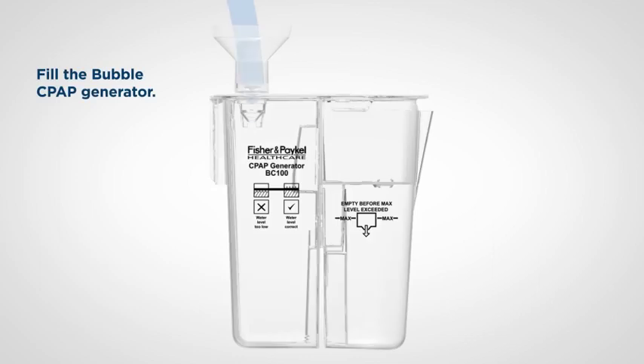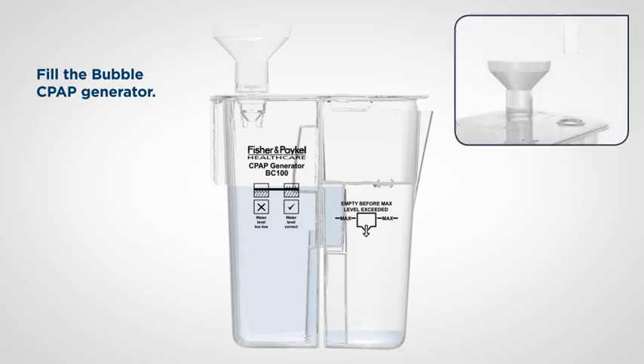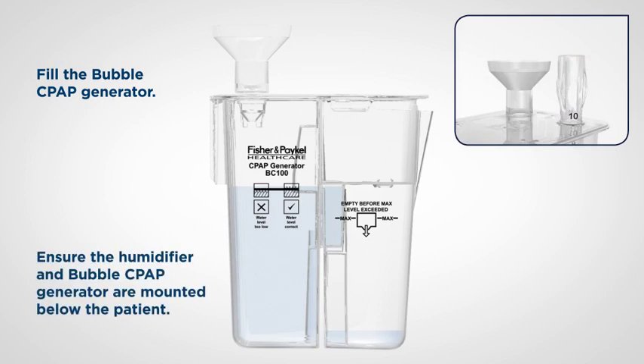Using the fill funnel provided, fill the CPAP generator with sterile water until the water reaches the maximum level and flows into the overflow container. Set the CPAP probe to 10 centimetres of water, ready for the leak test. Ensure that the humidifier and Bubble CPAP generator are below the patient.